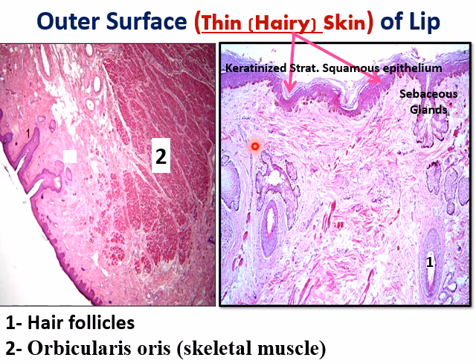Here, dear students, you can see the region of the lip. It contains the skin, keratinized stratified squamous epithelium. This is the hair follicle, and the sebaceous gland related to the hair follicle. Again, here this is the skin, and here is the muscle.